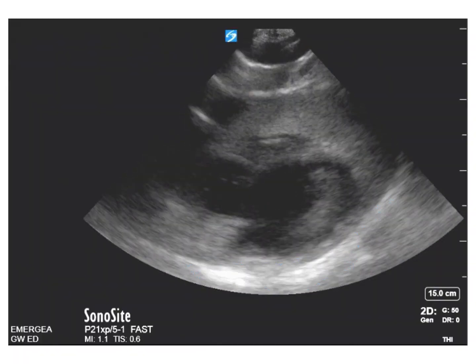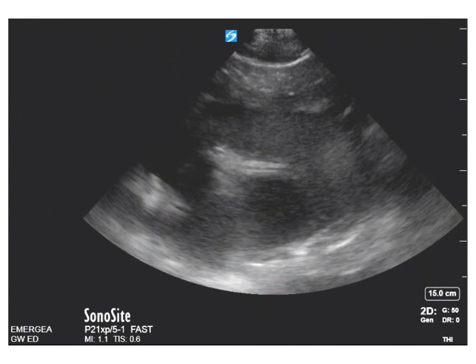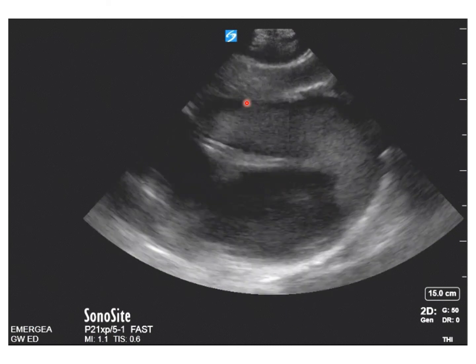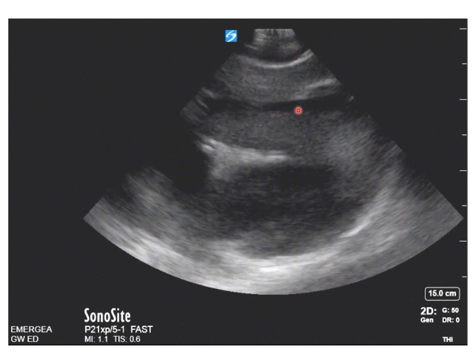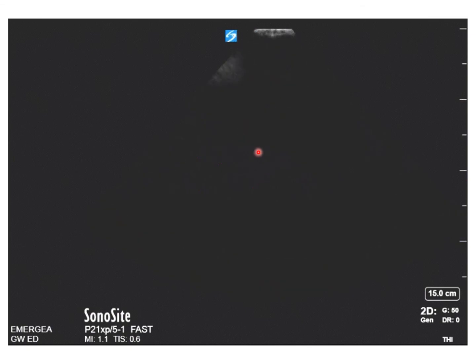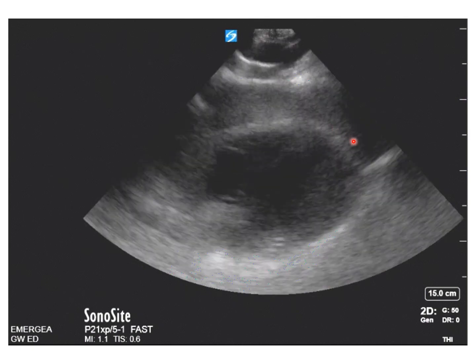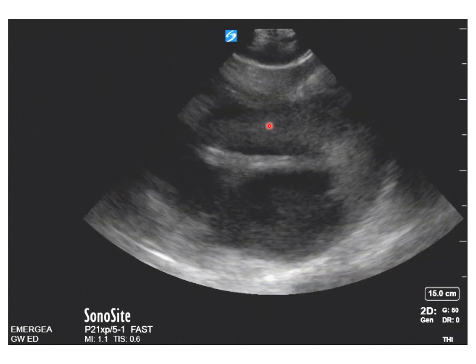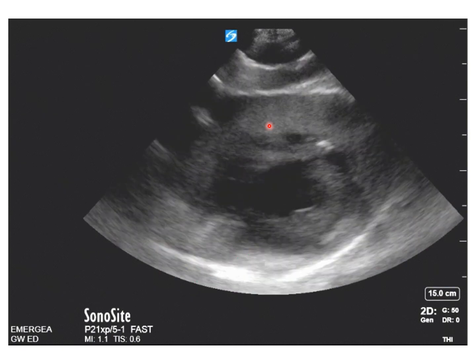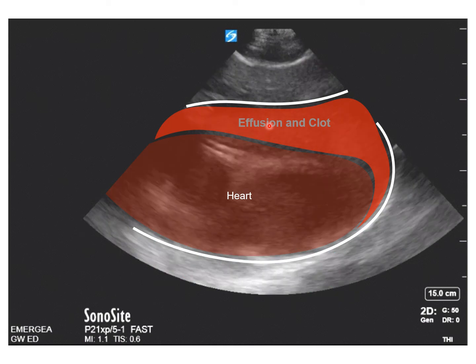What do we think of this image? Positive, negative. So you can probably see a small amount of fluid in this image here. But if you look, it looks like there's fluid there, and the pericardium is all the way down here. So what is this? It looks like it's outside the pericardium. So this is one of the possible false negative findings when you're doing the subxiphoid view.